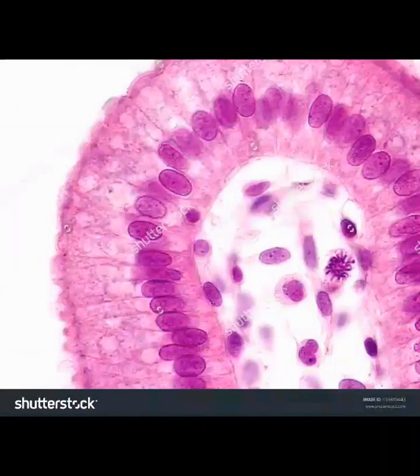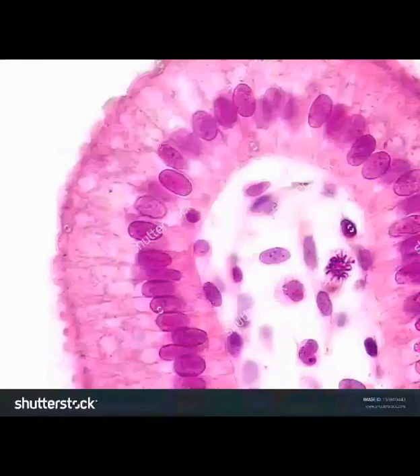So this is the slide of the gallbladder, and the gallbladder is lined with the simple columnar epithelial tissue. You can see that these cells are much more stretched out than the cuboidal cells. And also something I forgot to mention with cuboidal cells, the nucleus will usually mostly be a circle. And in here, if you can't tell what you're looking at, look for a stretched out nucleus that looks more oval shaped than the circle that you saw in the cuboidal cells. So simple, one layer of cells, columnar, epithelial. Remember, you can see that harsh line there and the empty space past it.